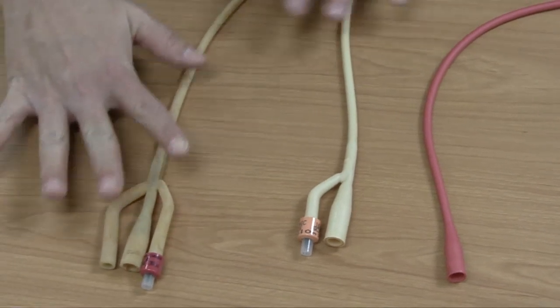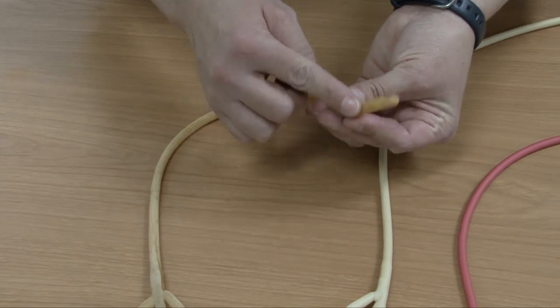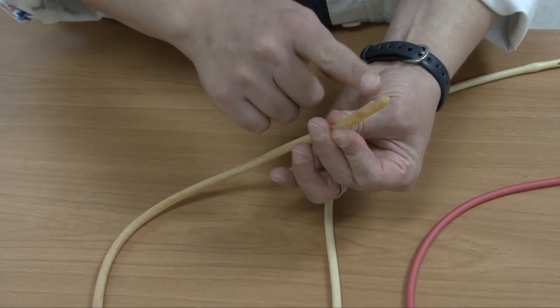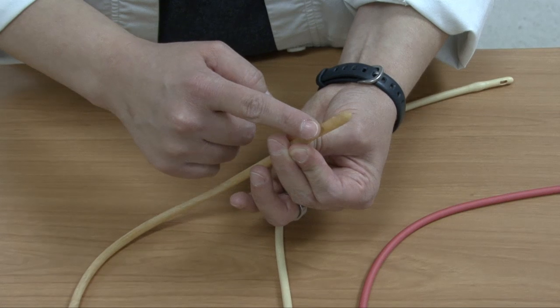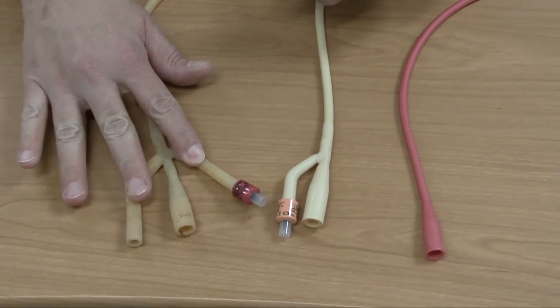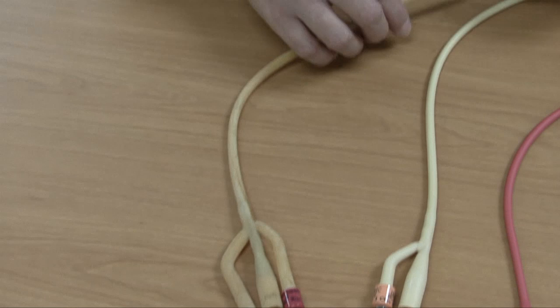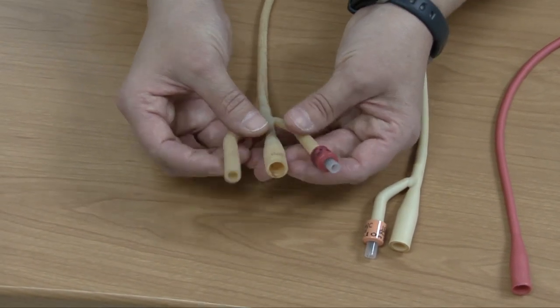If you look at this other catheter, you will notice it actually has three ends. This end still has the little open holes. One of the different holes allows for drainage of the urine; the other allows for installation of fluids. This catheter is what you would call a three-way catheter — it allows for drainage of urine and for irrigations. If you look at the end, there are three ends down here.